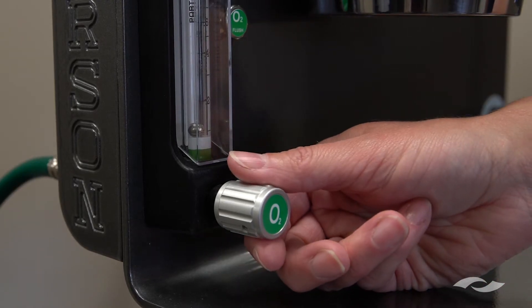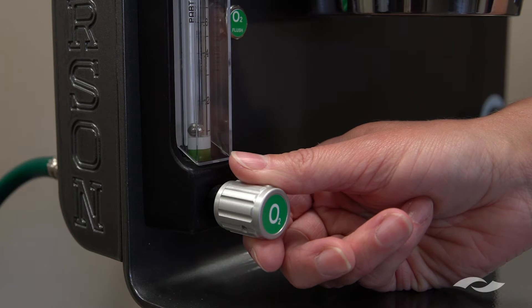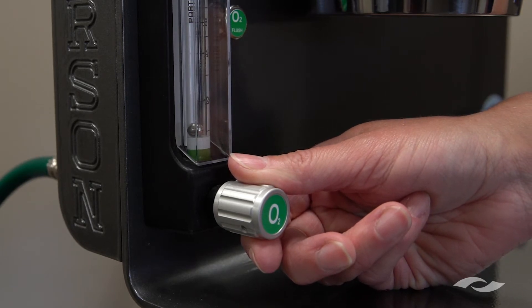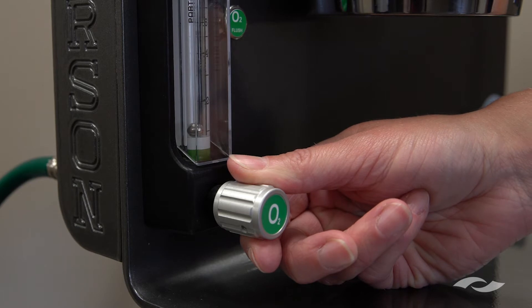The second step is to ensure that the oxygen flow is turned off at the flow meter. You can see here that it is, because the ball is at the bottom of the flow tube.